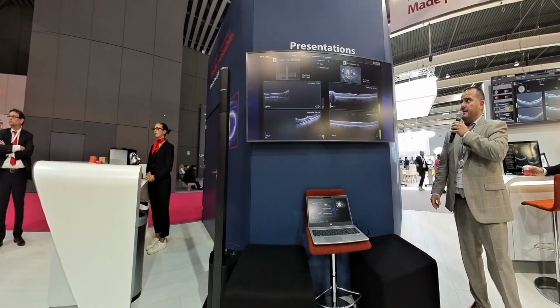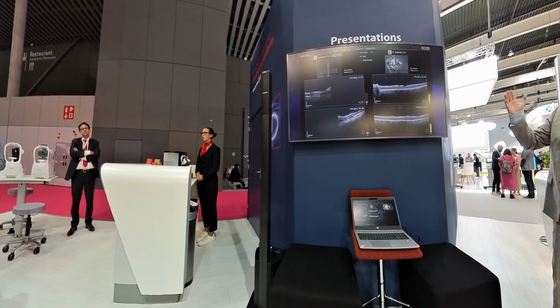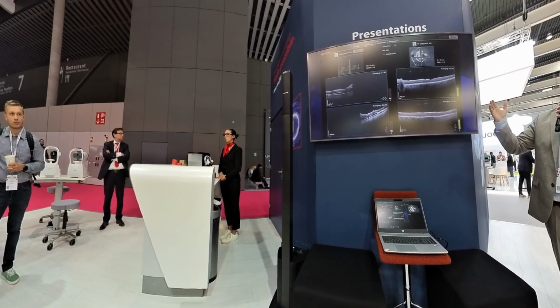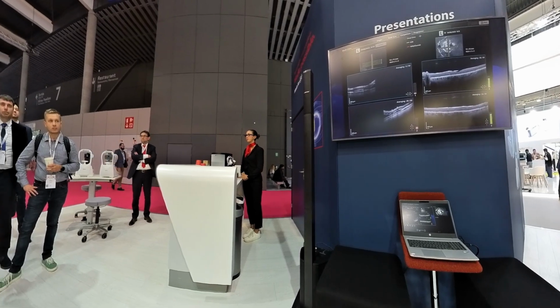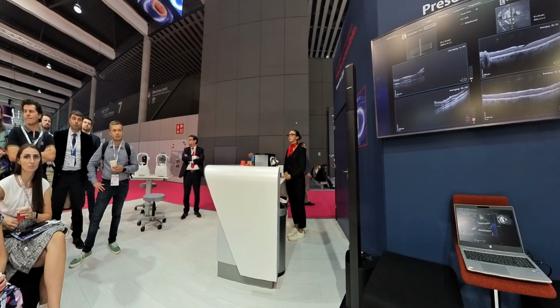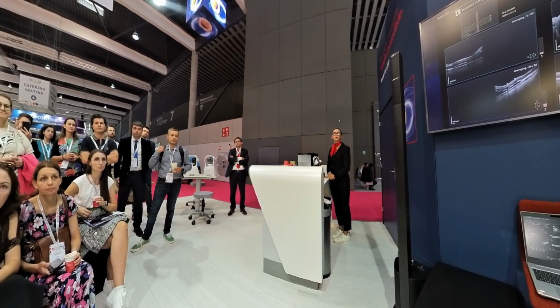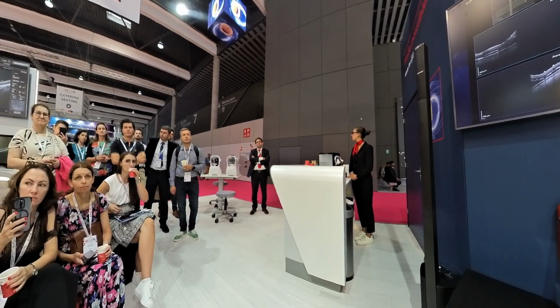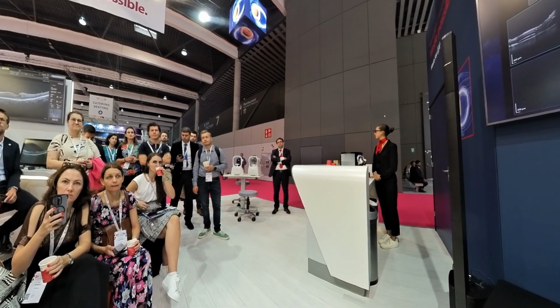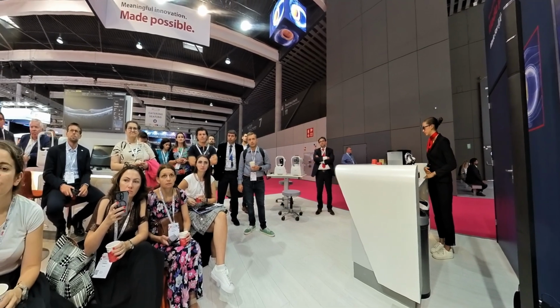Another thing that is quite useful is when on the first day we need to show the patient the result of our retinal detachment surgery. In this case, this is a silicone-filled eye, and we can show really well the layers and the shape of the macula, the silicone line and the type of the tamponade.